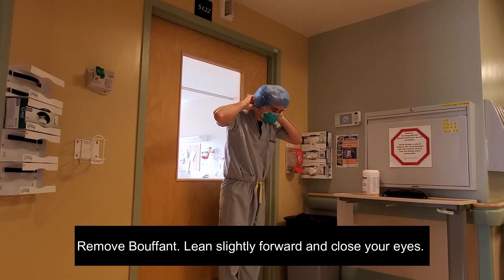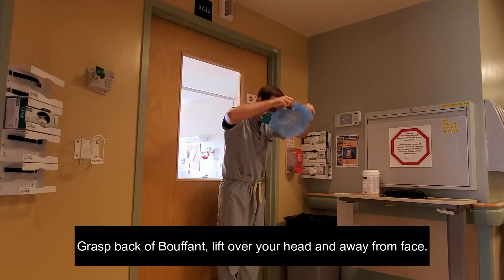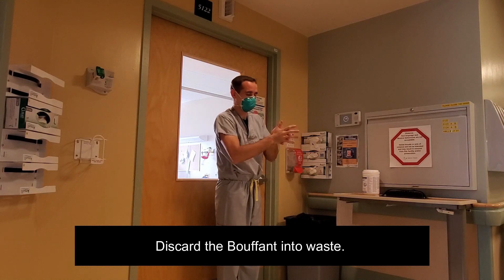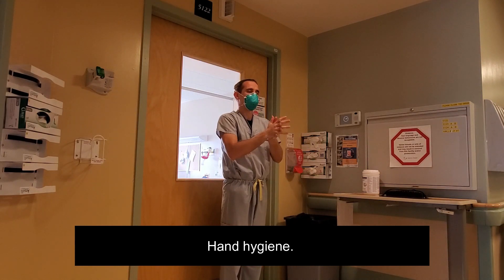Remove the bouffant by leaning slightly forward and closing your eyes. Grasp the back of the bouffant, lift it over your head and away from your face. Discard the bouffant into the waste. Perform hand hygiene.